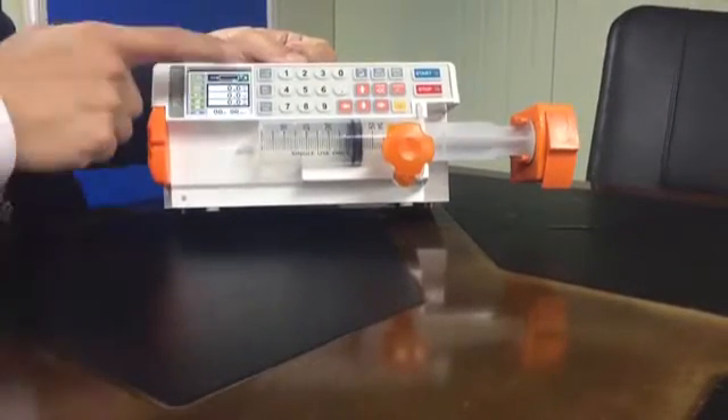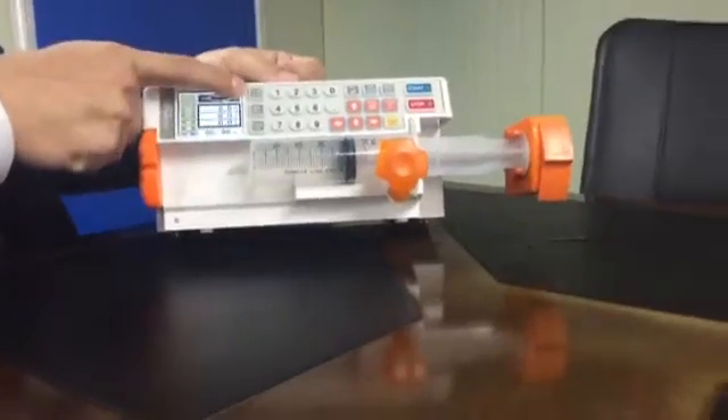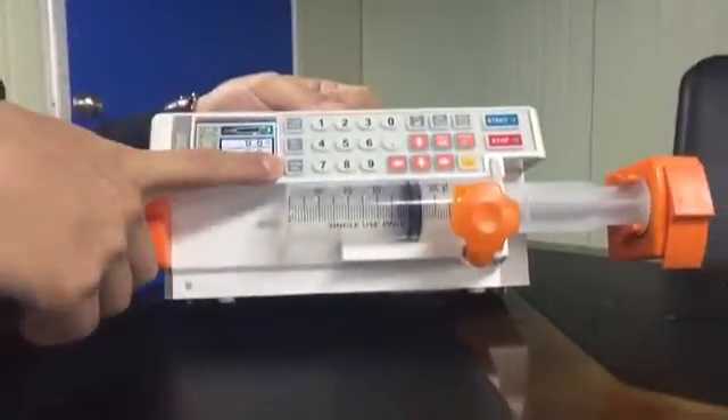There are three buttons here: flow rate, delivery volume, and total volume.